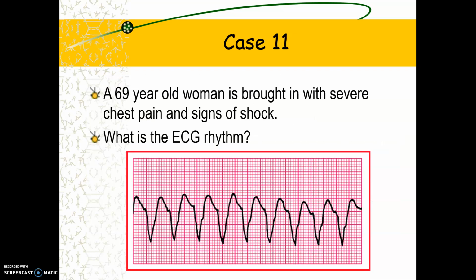What about this one? We saw this ECG before. The rate is 150 beats per minute, about two large spaces between beats. There are no discernible P waves, so we can't talk about the PR interval. It is regular, and the QRS complexes are obviously broad. Anything over 2.5 small squares represents a broad QRS complex, but this is obviously broad. In this setting, we would consider this to be ventricular tachycardia. The treatment depends on whether the patient is stable or unstable. We deal with that elsewhere.